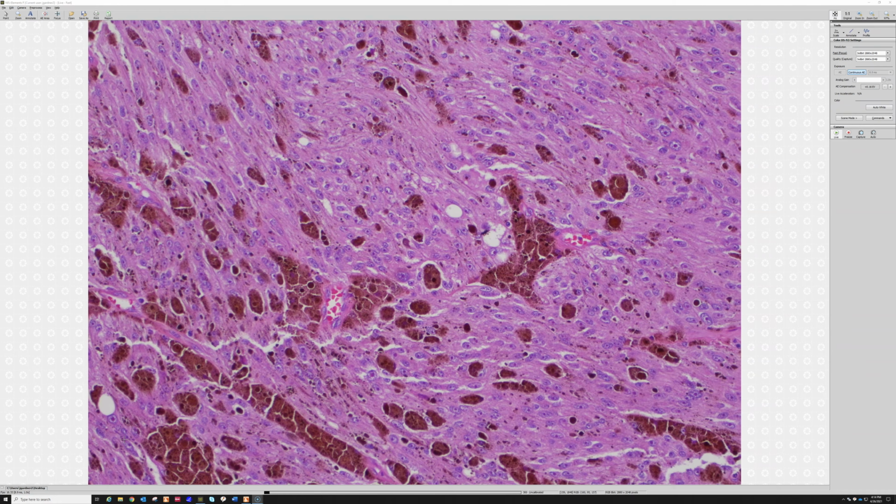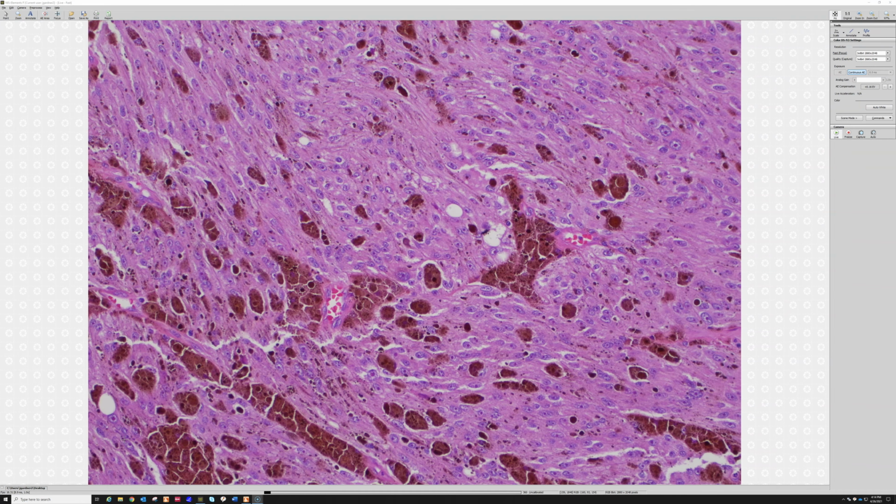I don't know that it's in every case, but it's a gene that's highly associated with Carney complex. And this tumor, which has a tendency to arise in patients with Carney complex, has loss of PRKAR1A. So you can either prove that by showing PRKAR1A mutations molecularly, or you can do the immunostain, which shows loss of expression of PRKAR1A.